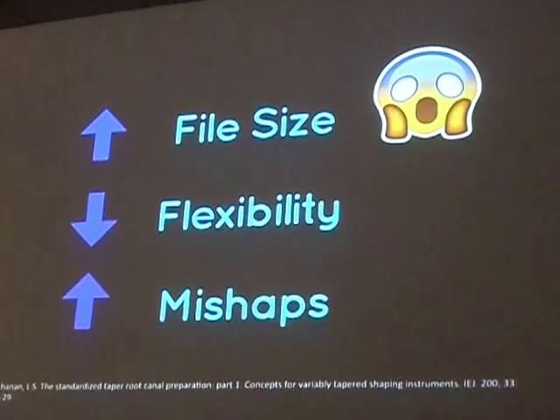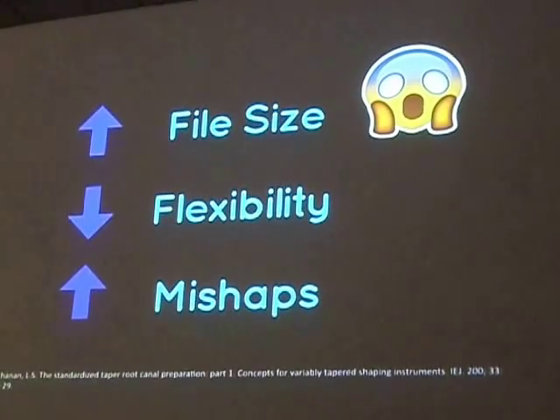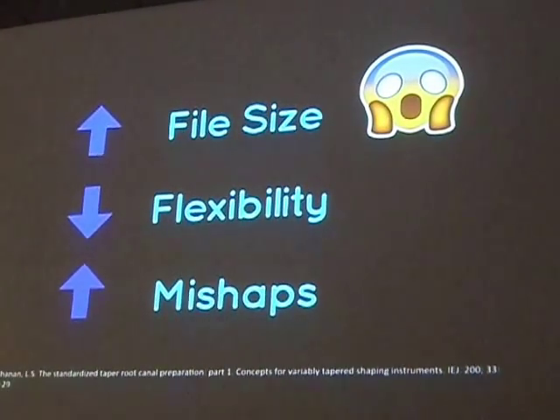So what we see is that as we increase our file size, we decrease the flexibility of the actual file, and therefore we increase our mishaps.